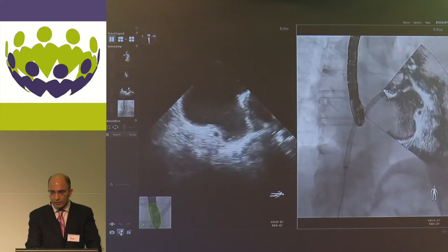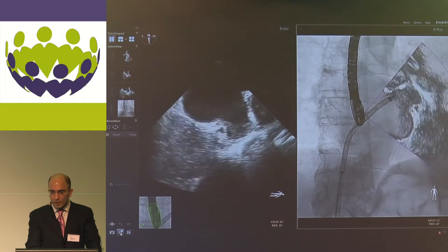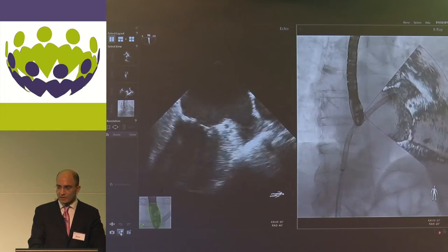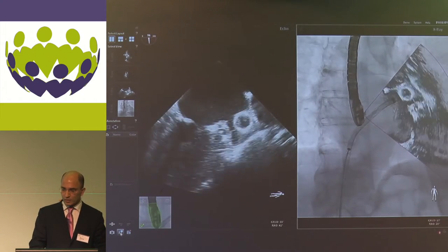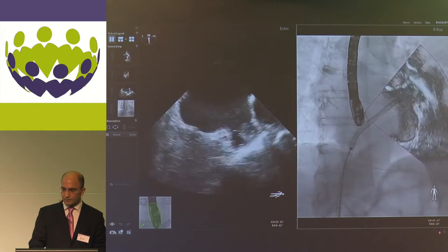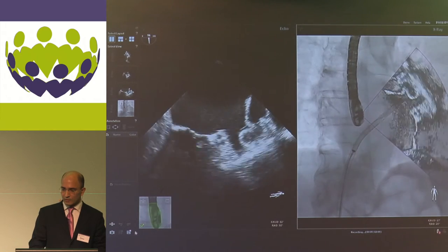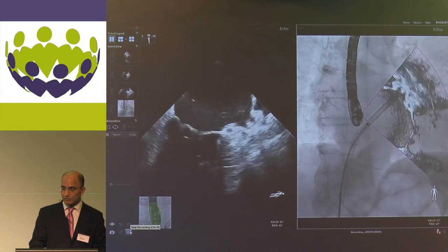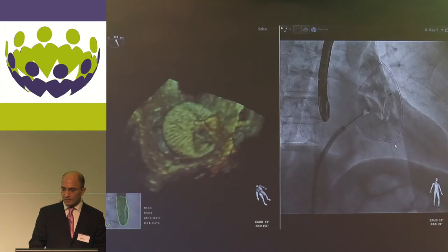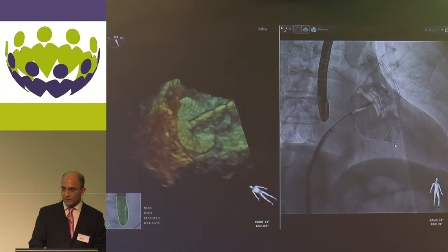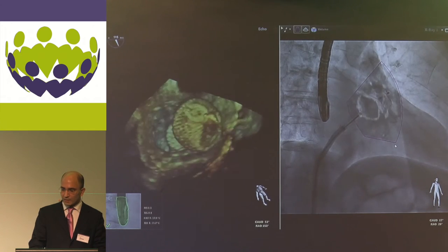Here you see the classical steps for deploying an Amulet device. The delivery sheath is placed in the left upper pulmonary vein, then moved into the appendage, and every step can be visualized by looking only at the fluoroscopy screen. We open the lobe, perform counterclockwise rotation, and deploy the lobe of the device. Even the circumflex artery is visible on the fluoroscopy screen, confirming sufficient depth within the appendage. The disk is then released and both images confirm acceptable position.